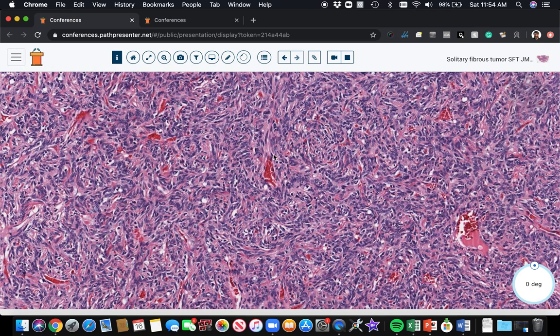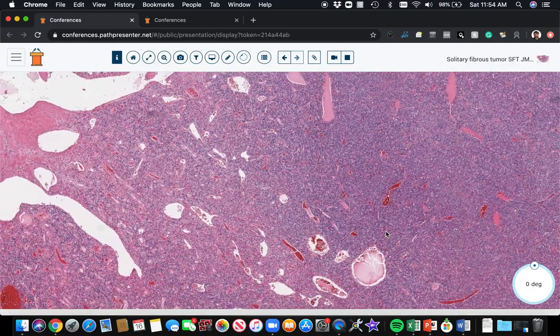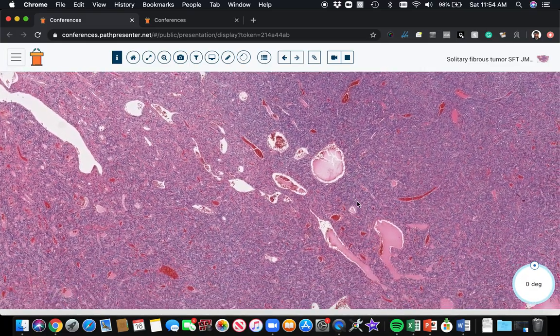And it's a beautiful, very nice, strong nuclear marker that will stain these. And it's relatively sensitive and specific so far for solitary fibrous tumors. So STAT6 is the marker to remember for solitary fibrous tumor.